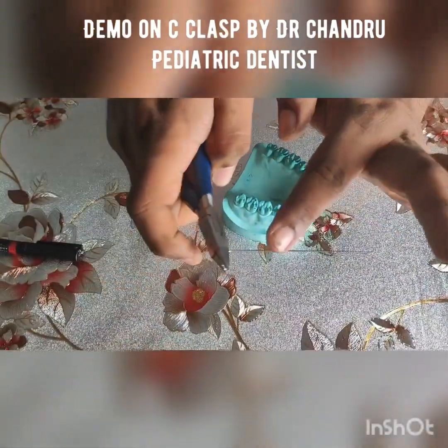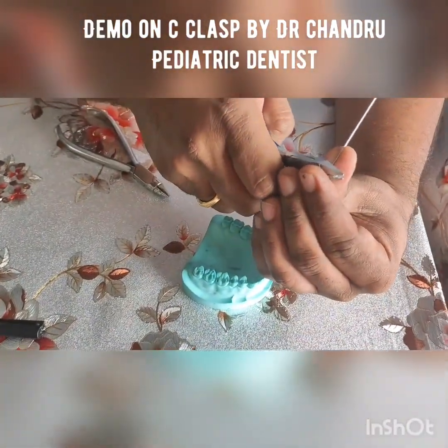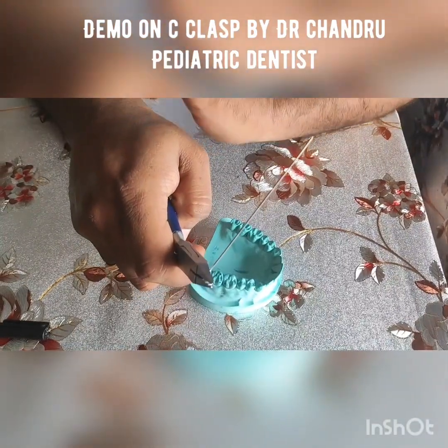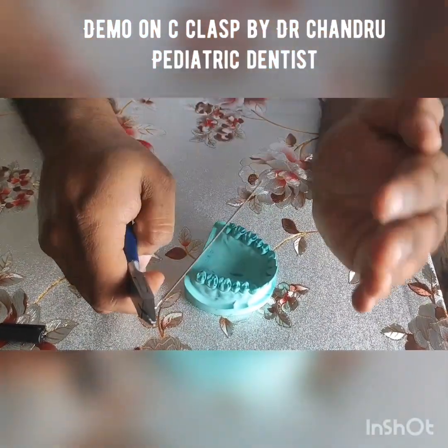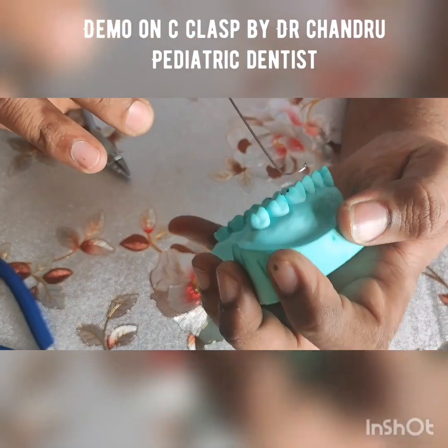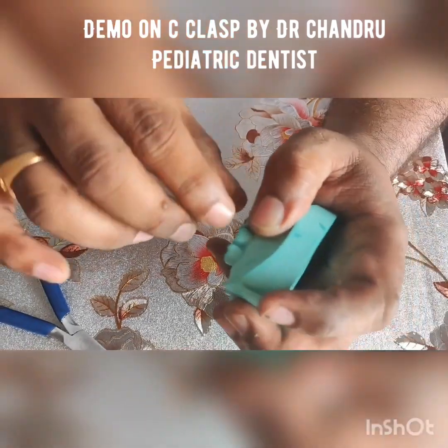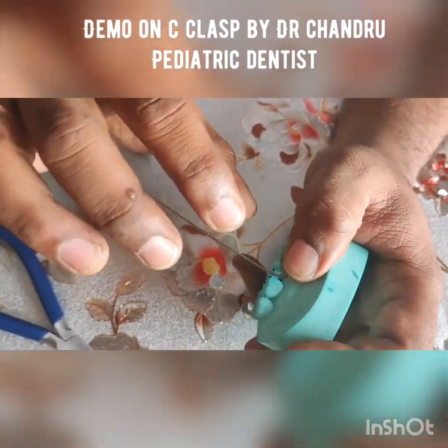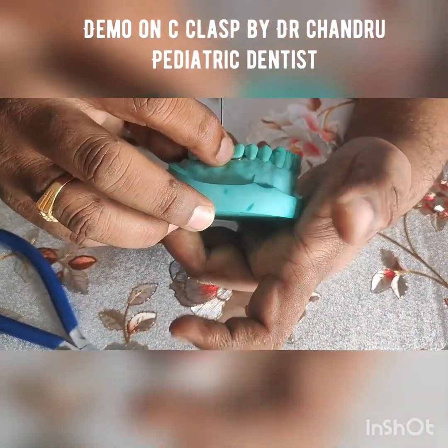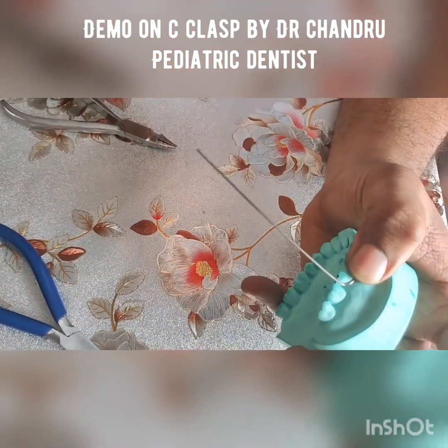We can see that the two ends, the mesial undercut as well as the distal undercut, have been held and a reverse bend is given, that is the bend is given away from the tooth surface. That is the meaning of that. Mainly it is done because the embrasure is just placed inside the cast area. So by doing this, you will be able to achieve a close approximation of the wire from the mesial side to the distal side, engaging the whole embrasure without any space.